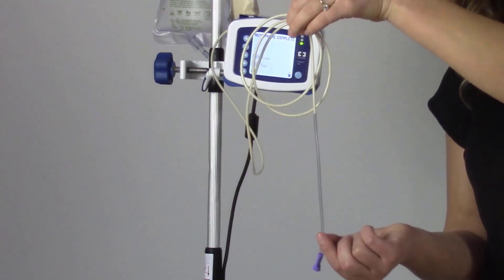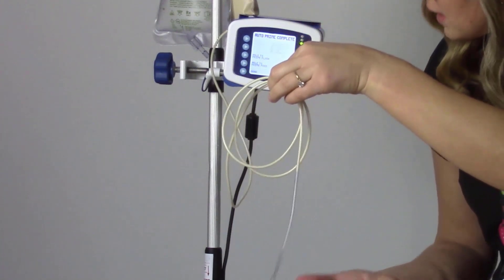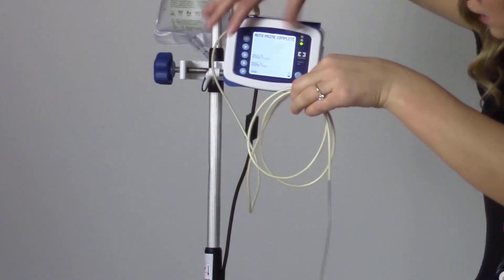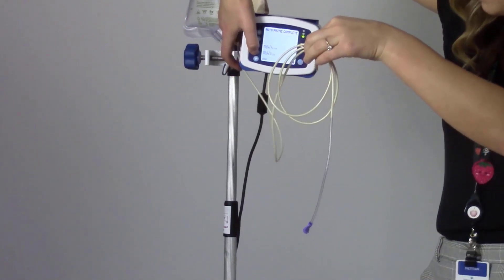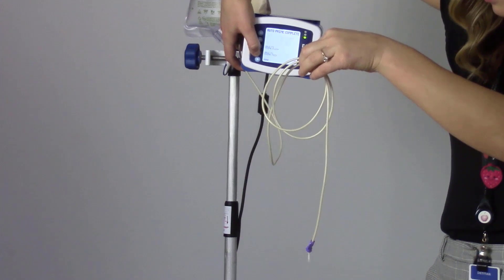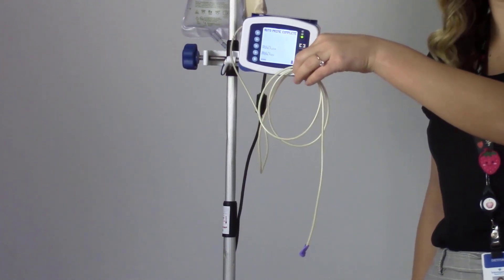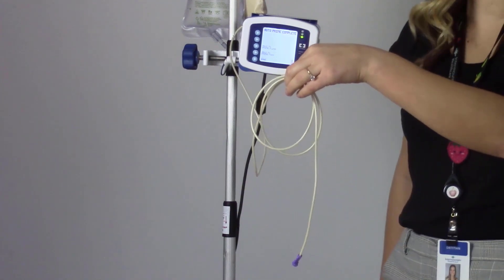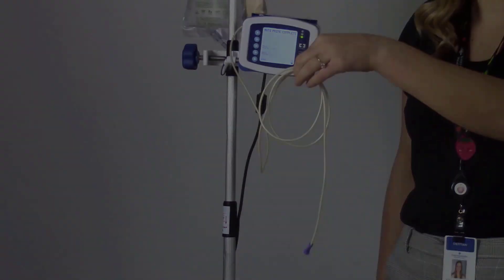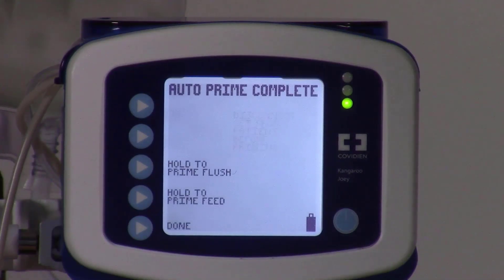We can see that there's still a small amount of air in the line, so I'm going to press and hold 'hold to prime feed,' which will finish the priming for us. We can see a little bit of formula drip out, indicating that there's no more air in the line and we're okay to start our feeding. Now that the tubing is filled with formula, we're good to press done.